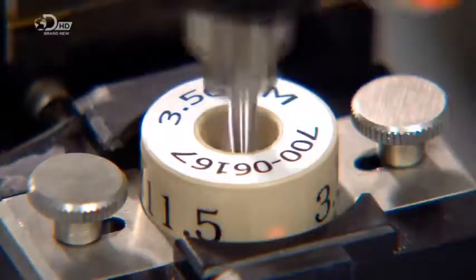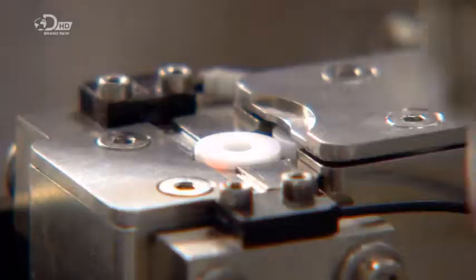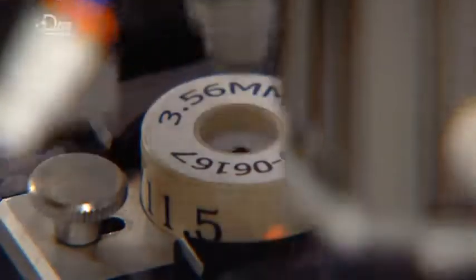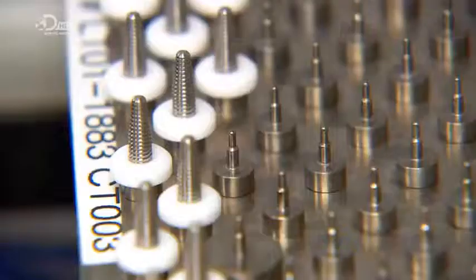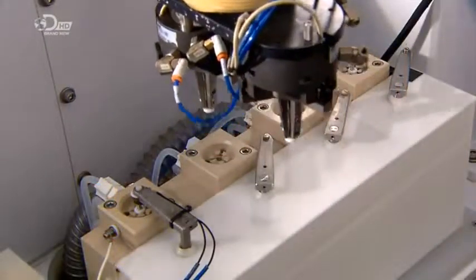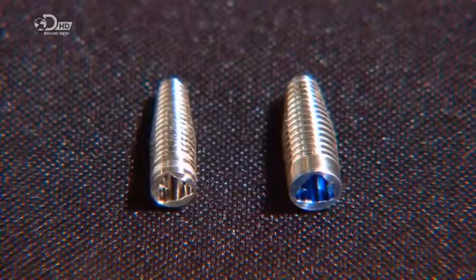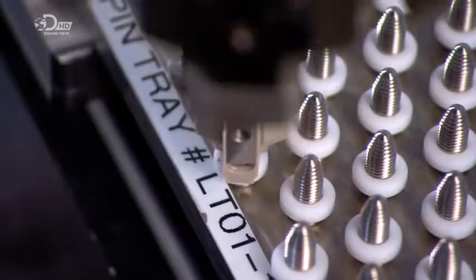An implant is transferred to a holding device which secures it for the next robot to press a plastic collar onto it. This collar is temporary — it will serve as a mask to protect the outside of the implant as the top undergoes a process of colorization. A robot places the implant upside down in a mild acid and then an electrical charge is applied. Different colors appear at different voltages to color-code the part and indicate the diameter. The process is called anodizing.